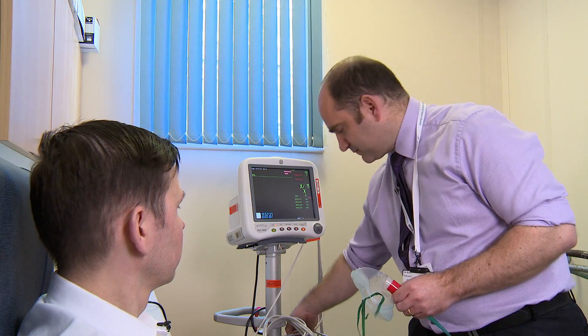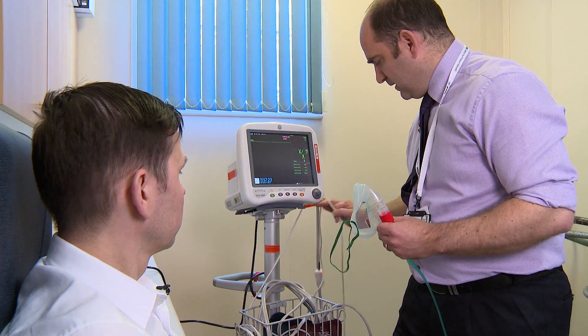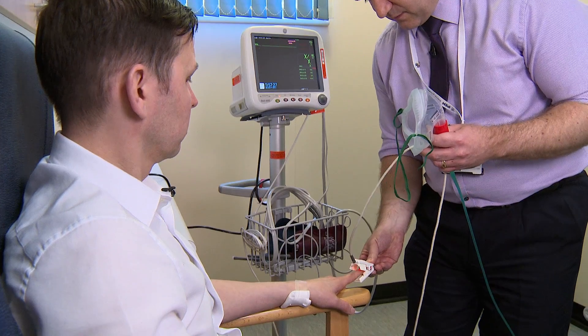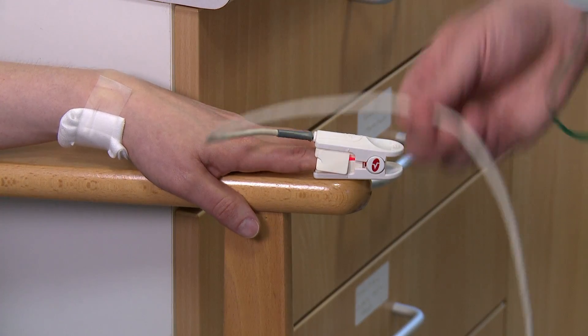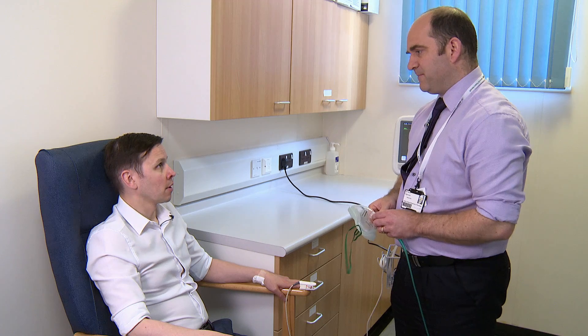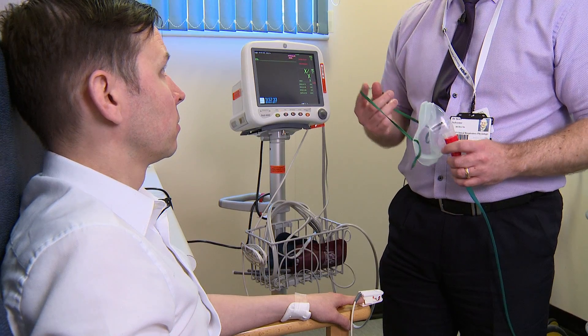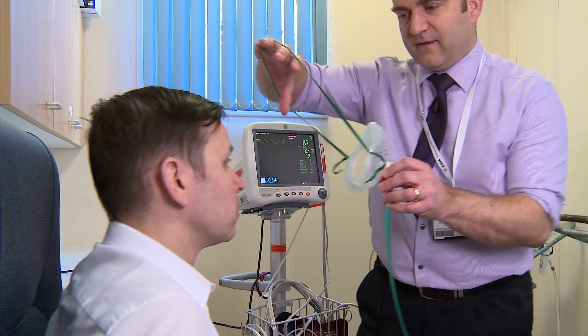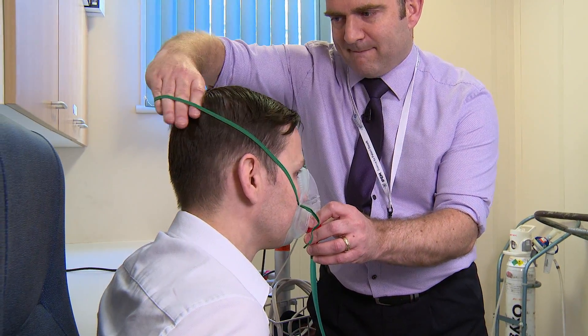Okay. First thing I'm going to do is pop the probe onto your finger. Do you have any questions at all? No. Fantastic. And while we're waiting, I'll just pop this mask over your nose and mouth. Do that up, make sure that's nice and snug.